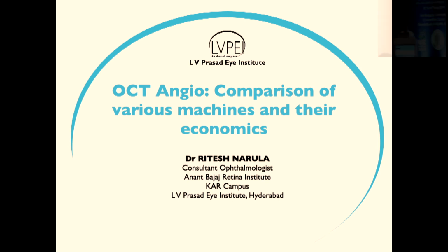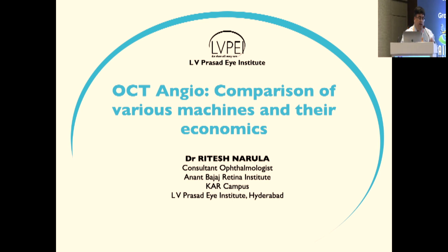Very good afternoon to all of you. Thank you, Dr. AVNINDRA, for inviting me to this interesting session. OCT angiography, as he rightly said, is the new baby on the block, which everybody is now looking at, wants to use, wants to acquire. So it's important to understand what our available options are, and I'll touch upon the economics. I'll give you the economics of it, and then you can decide how much economics suits you or doesn't suit you.